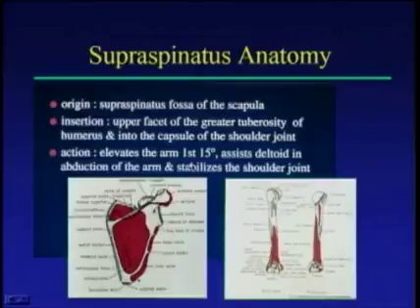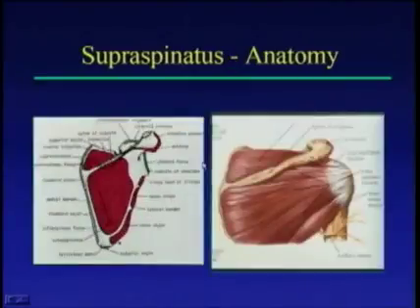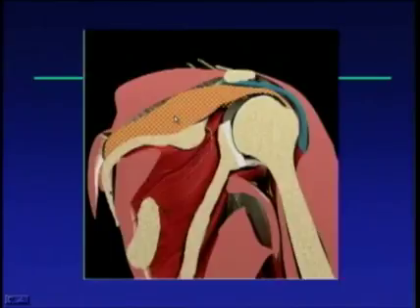Next, we look at the supraspinatus anatomy, the most important structure to evaluate in the shoulder joint. You're looking at the origin of the supraspinatus muscle and the insertion of the tendon on the greater tuberosity. The supraspinatus elevates the arm for the first 15 degrees, so patients with supraspinatus problems typically have difficulty elevating the arm in that first 15 degrees. The acromion sits on top, and when scanning anteriorly it will shadow onto the supraspinatus tendon, so you need to position the arm in a particular fashion to move away from this bony landmark.